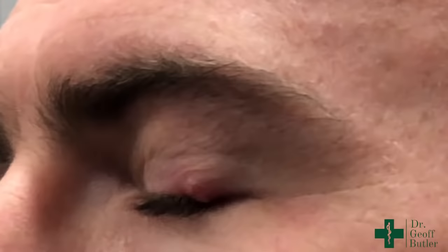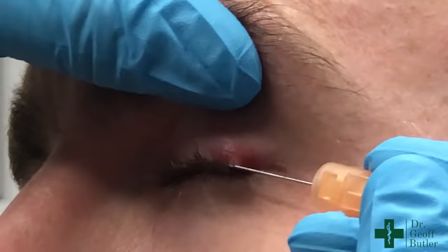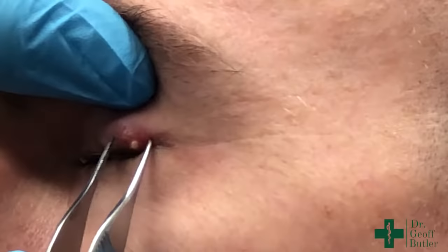There's no anesthesia here — poking into this is a little difficult. We use a fine needle; I just want to unroof this a little bit. All I'm trying to do is just open this just a little bit like that, and then we use a pair of pickups to put pressure behind it.